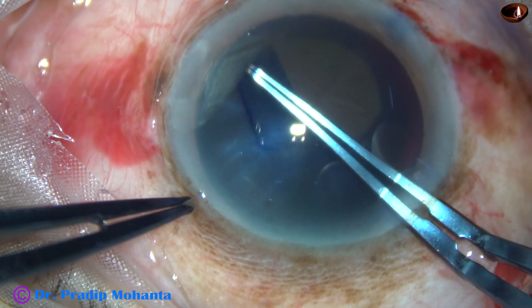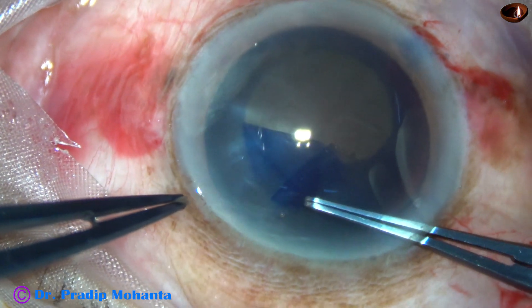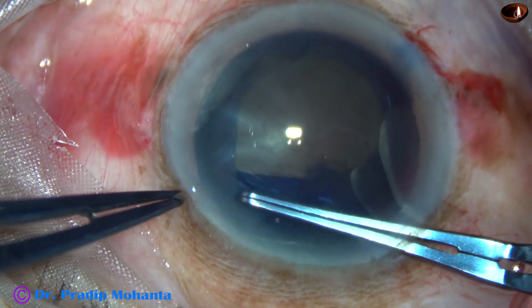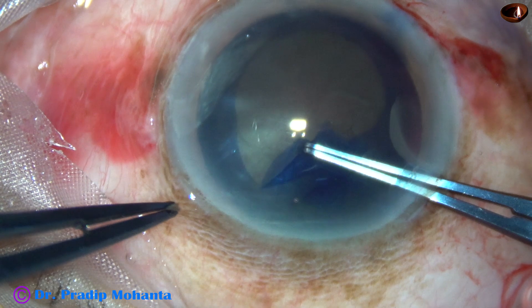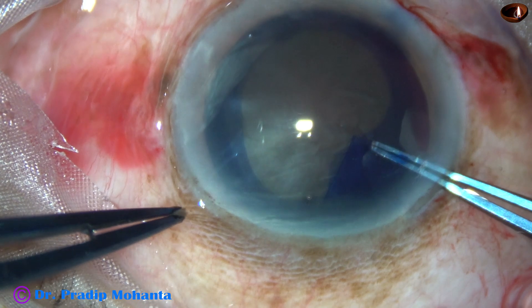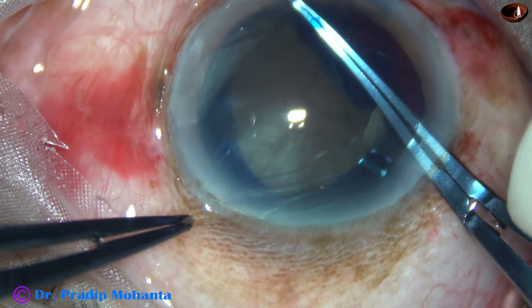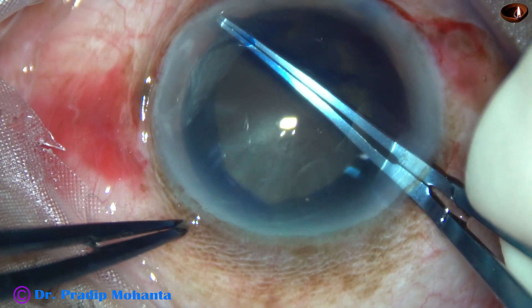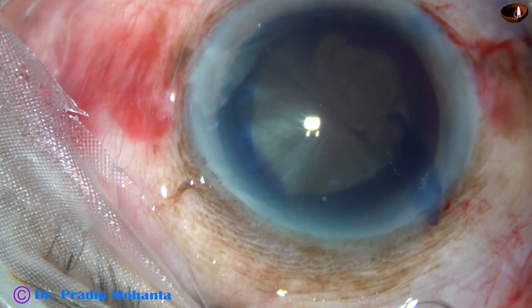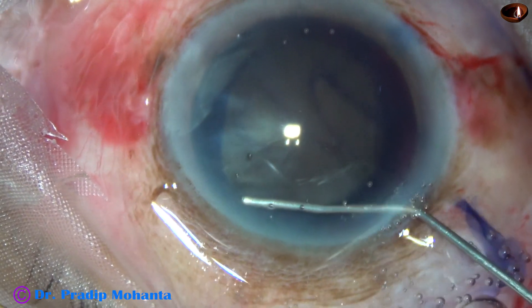The nucleus is huge, and if I do a small rhexis, management of this nucleus will be very, very tough. So my plan is to do a large rhexis. Here at around 1:30 o'clock the rhexis tended to go to the periphery, but I could retrieve it easily. The rhexis is not round, but it is large and adequately sized.